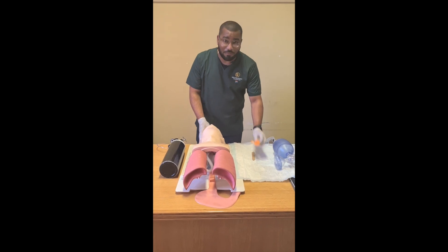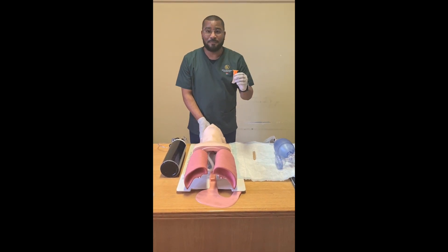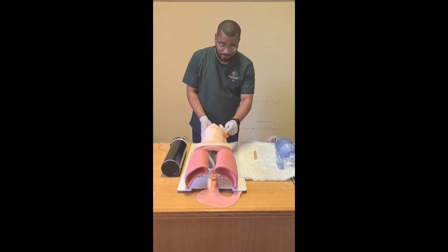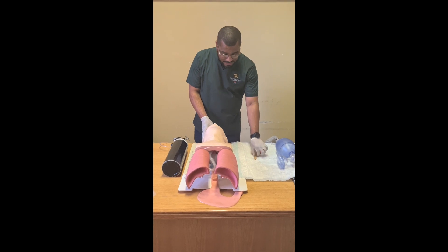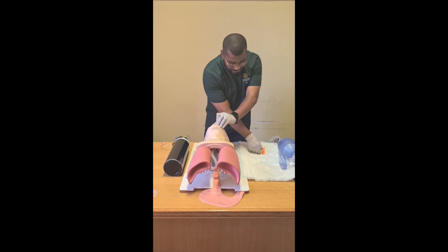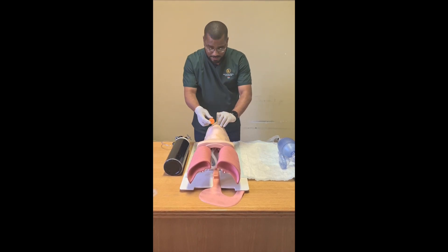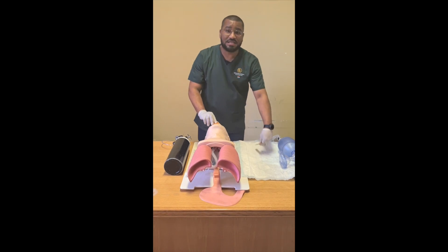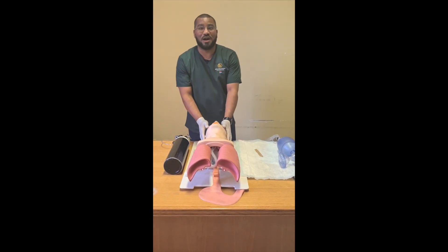I will then proceed by measuring my OPA. That is done from the tip of the ear to the opening of the mouth. I will then use my tongue depressor to gently depress the tongue and insert my OPA accordingly. Once my OPA is inserted, my airway is now open.